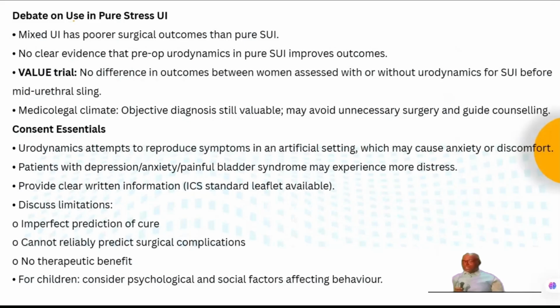Okay. Then what are the consent essentials? Urodynamics attempts to reproduce symptoms in an artificial setting, which may cause anxiety or discomfort. Patients with depression, anxiety, painful bladder syndrome experience more distress. We need to give clear information. Okay. So a patient information leaflet is available as per the ICS standard. This leaflet is available and we need to provide it.